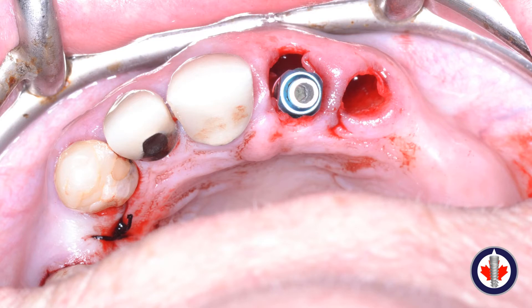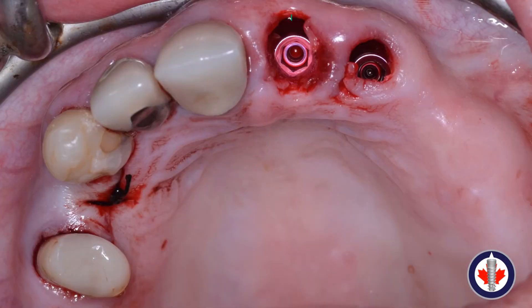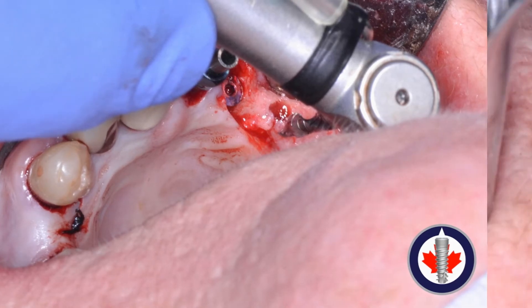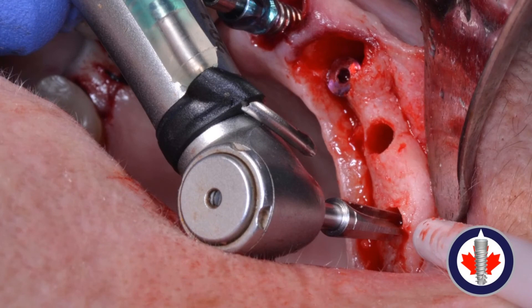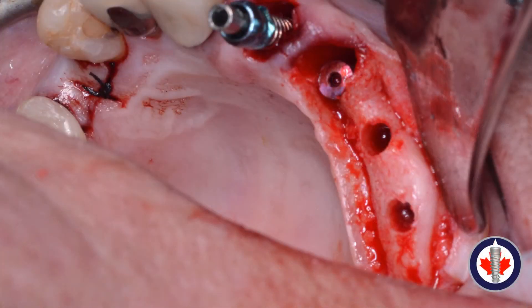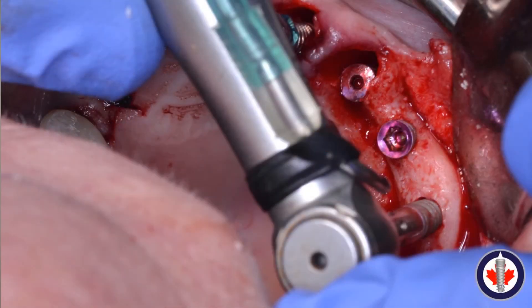We've taken an impression coping and placed it into the primary implant to use as a guide for angulation, so that when placing the other implants we can keep them somewhat parallel. This allows us to take advantage of the internal hexes for the implant-retained bridge without needing multi-unit abutments. The second implant is placed. For implants three and four, a flap is made to expose the bone. These are MIS-7 implants using two simple drills plus a final drill. The osteotomies are completed and the implants are torqued into position at the appropriate bone level.